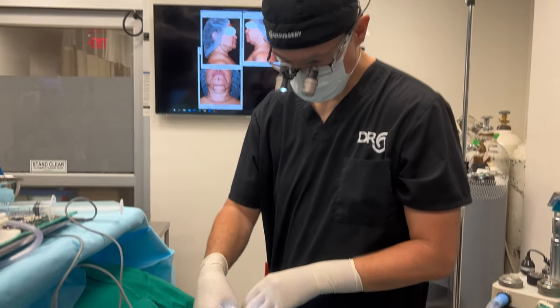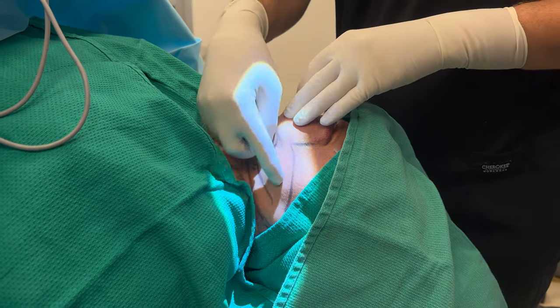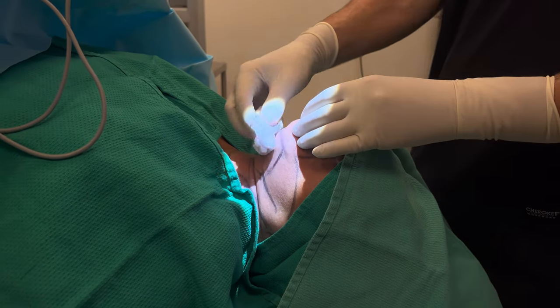We're going to get started. First, I'm going to infiltrate some tumescent solution — it has local anesthetic plus epinephrine to minimize bleeding. We'll do a liposuction and then remove this chunk of fat that she has here, and tighten the deep muscles.